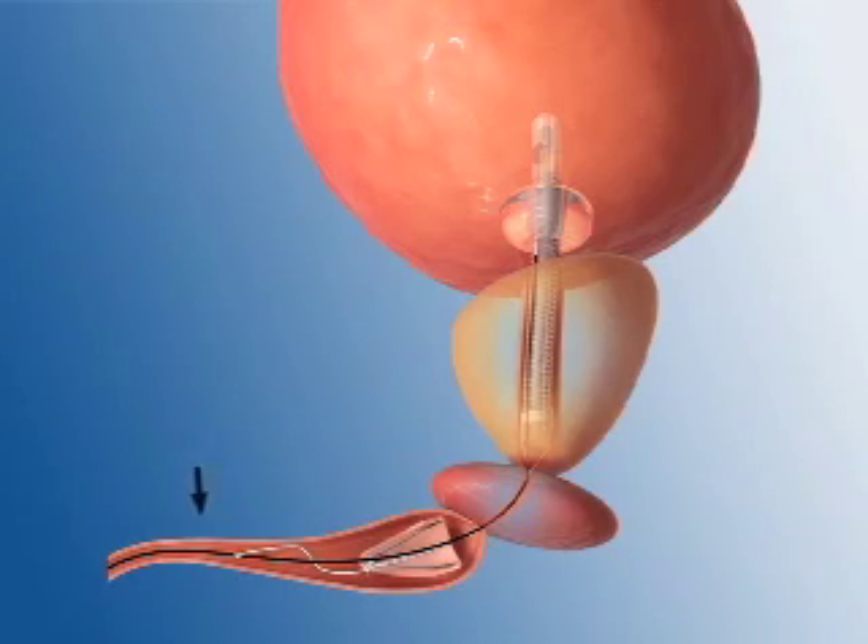Lastly, there is a retrieval string that extends into the pendulous urethra and is used to deflate the balloon and remove the device.